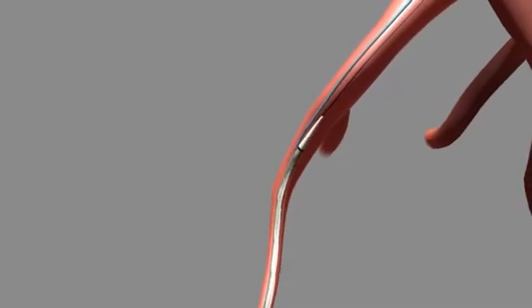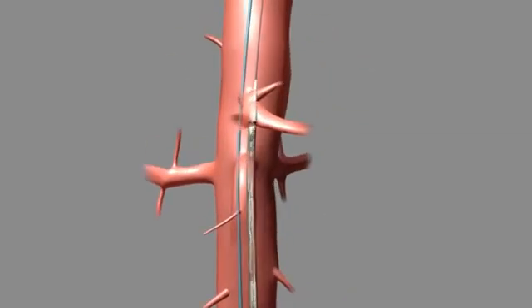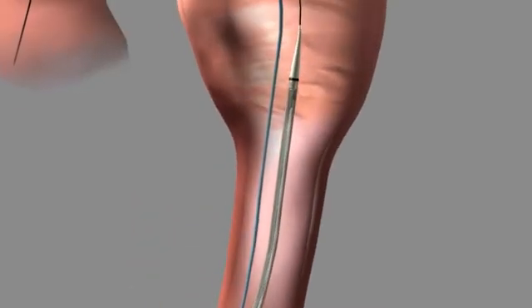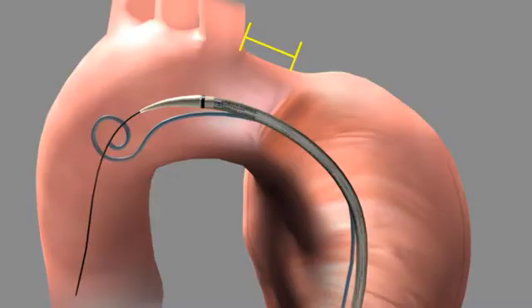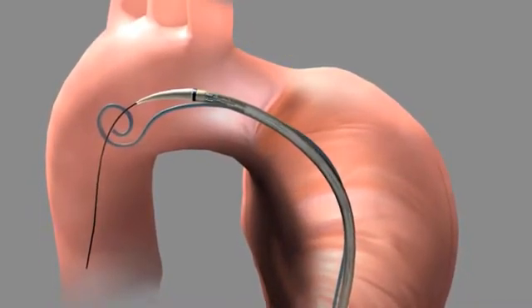Insert the delivery system over an 0.035 stiff guide wire and monitor the proper orientation of the connecting bar while advancing the stent graft. Ensure the proximal and distal springs are placed in adequate landing zones, at least 20 mm of healthy tissue both proximal and distal to the aneurysm.